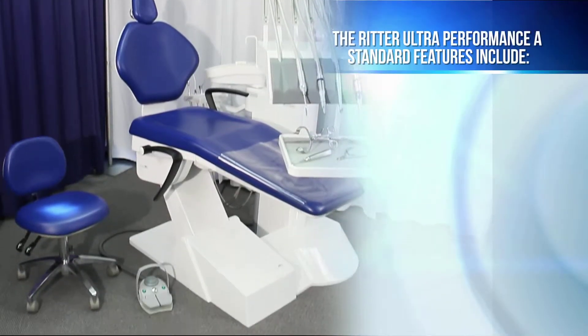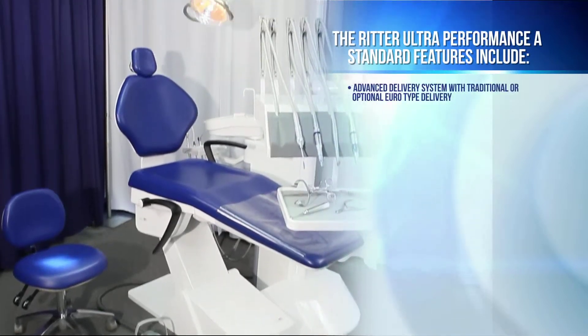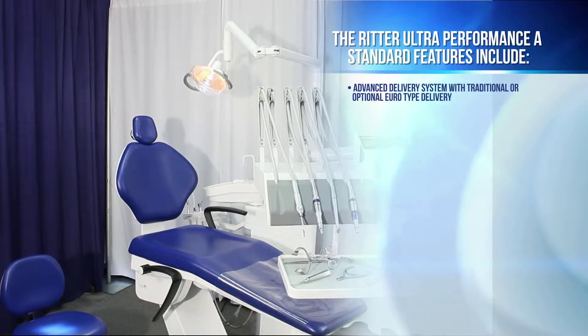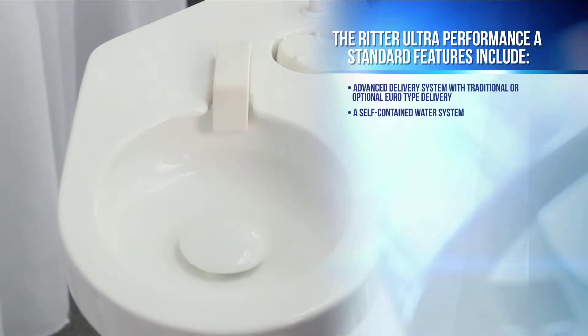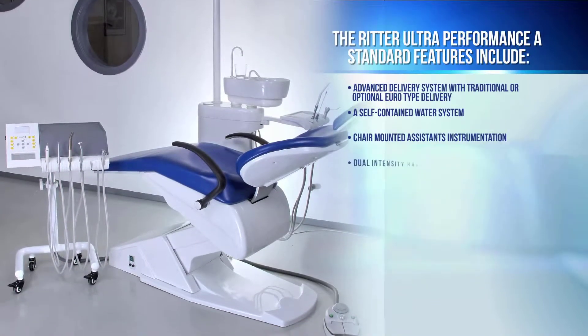The Ritter Ultra Performance A has many standard features that include an advanced delivery system with traditional or optional Euro-type delivery, a self-contained water system, chair-mounted assistance instrumentation, and a dual-intensity halogen operating light.